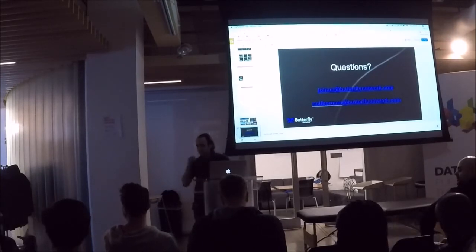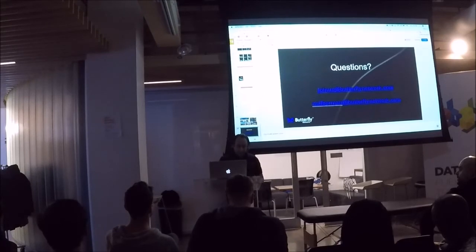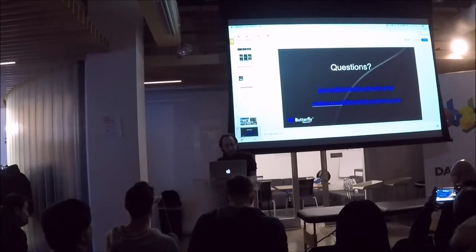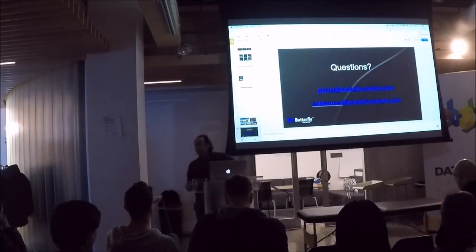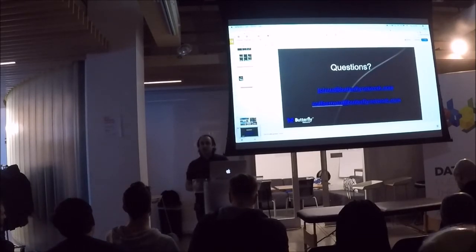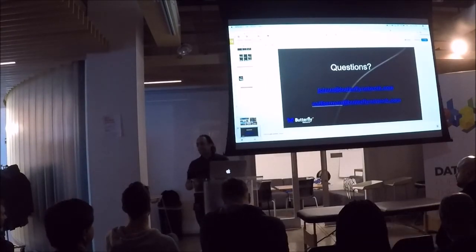Are you collecting all these images so you can further improve when they use this device? Yeah, that's a great question. One of the things I also didn't mention is Butterfly's cloud. If you are in a Wi-Fi area, it's very easy to collect an image that you're doing on a patient and immediately upload it to the cloud. Let's say you want to share it anonymously with someone, or get a second read. All that is enabled by Butterfly's cloud, and everything is stored online.